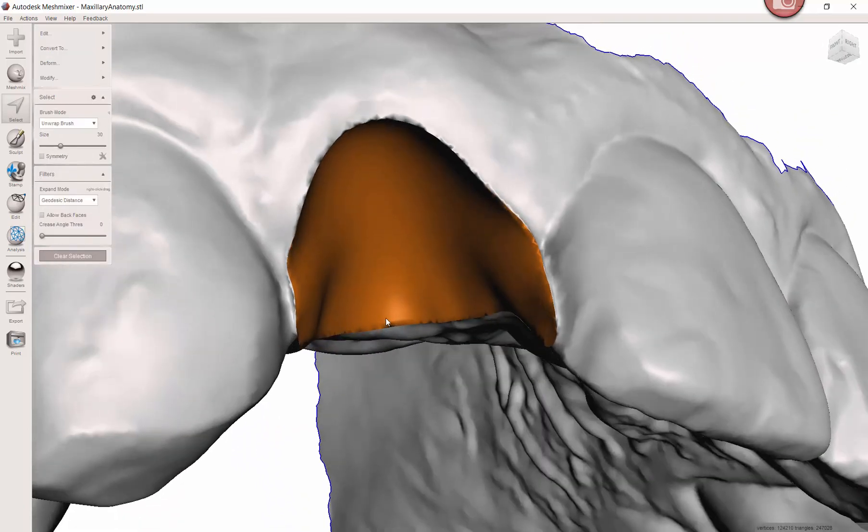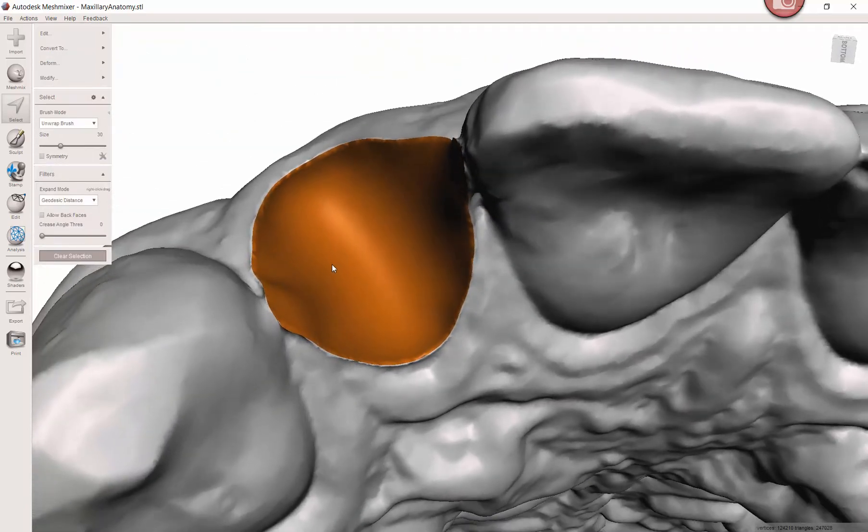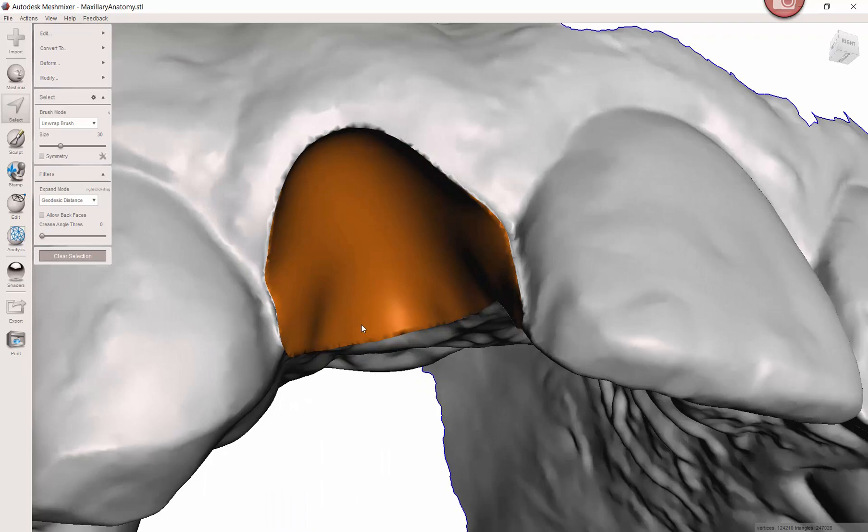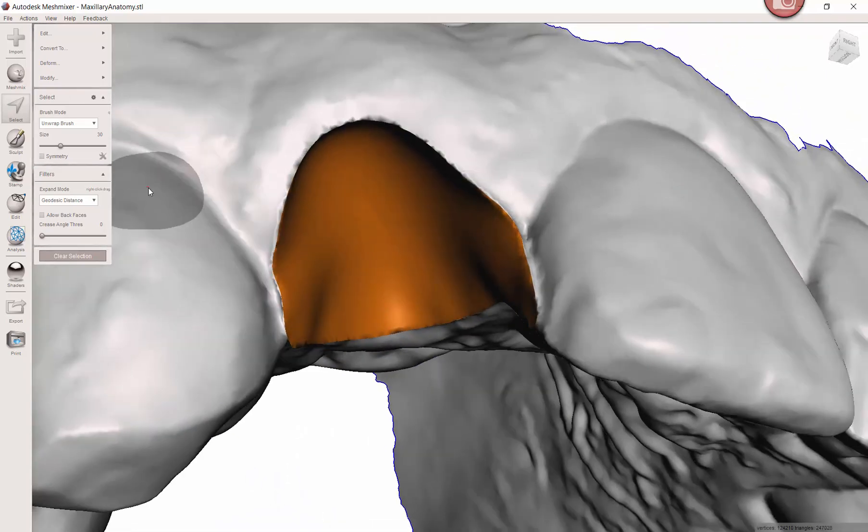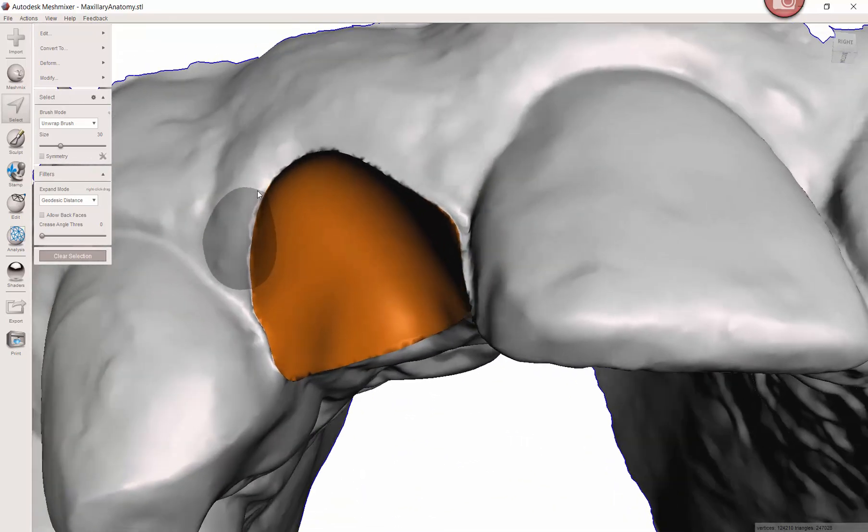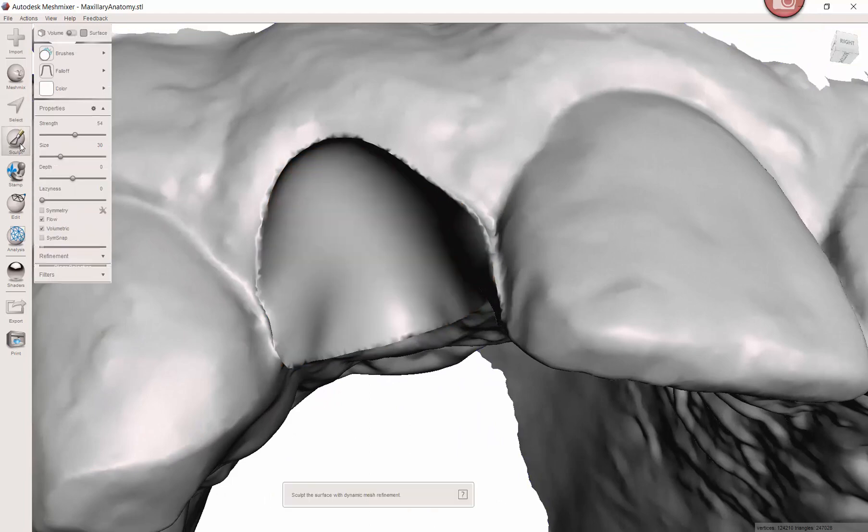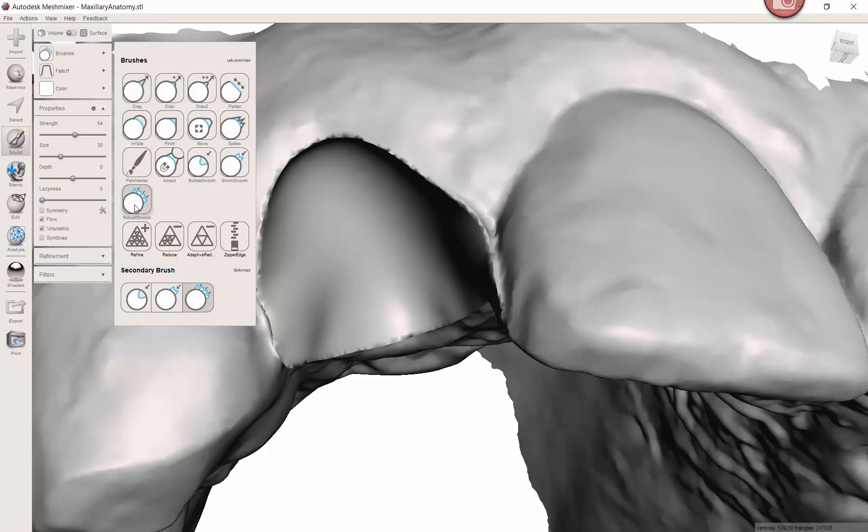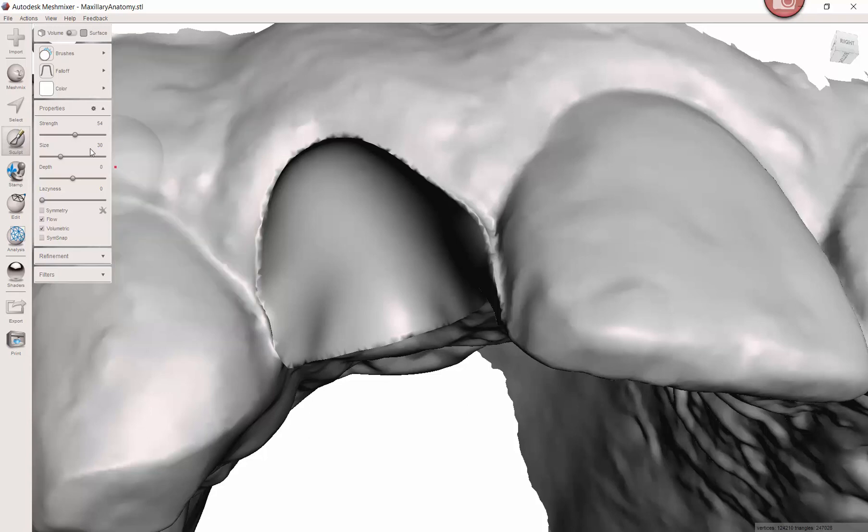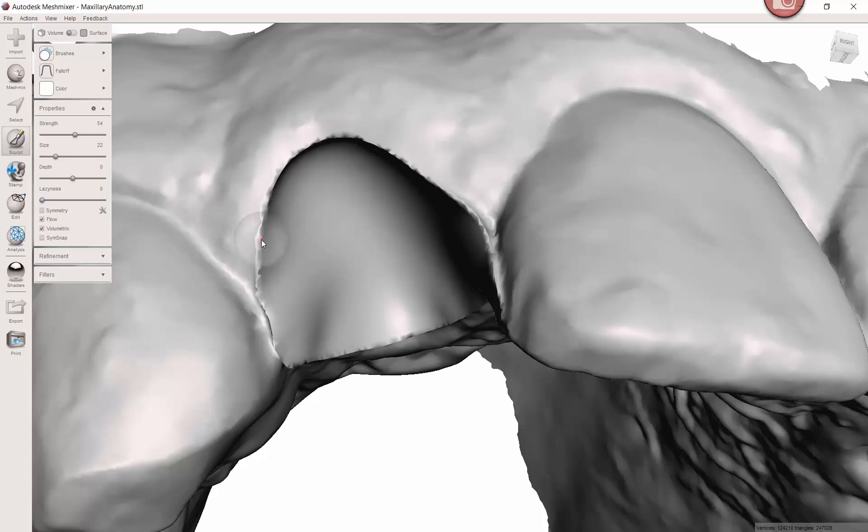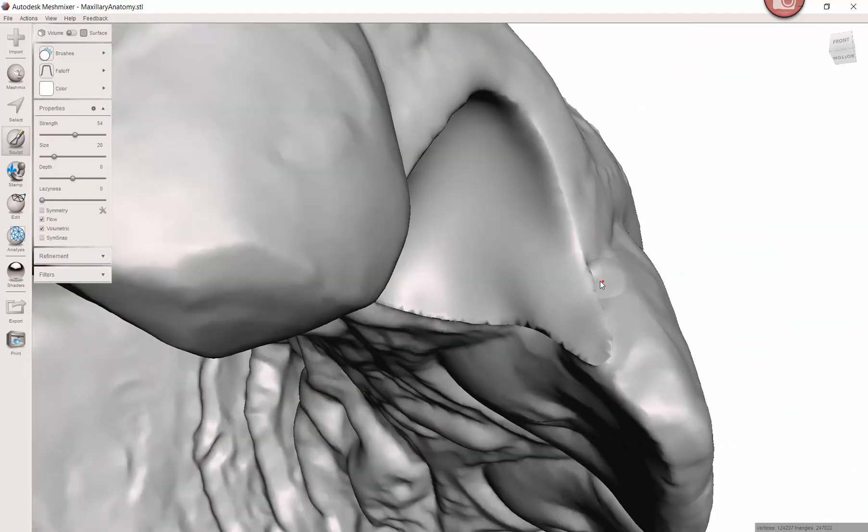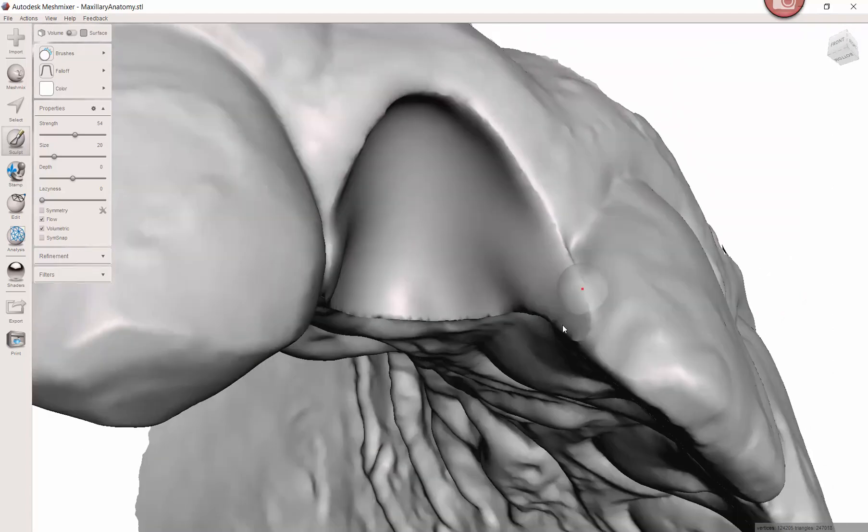If you do want to go to the extra step, you can come over to the sculpt tools. The majority of the time if I'm using sculpt, it's just this robust smooth tool. You don't need it real strong, 50% is probably more than adequate. Once again, the bracket buttons or this little size dial. I just tap, I'm not clicking and dragging because if I do I can potentially overdo your smoothing.